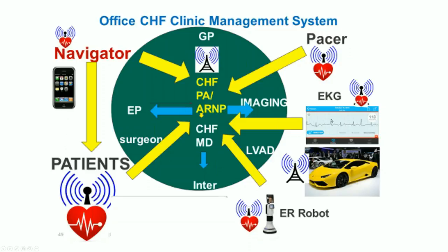Many of our patients who have arrhythmias will purchase one of these at Amazon for about $75. They put the attachment on their iPhone, put their fingers on the plate, and are able to transmit EKGs to my email address. And I can just look them up. I get several EKGs a day, sometimes maybe too many a day, but I get them to look at them and help patients that way.